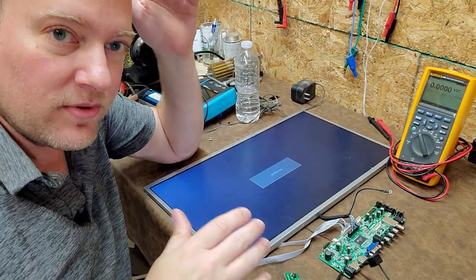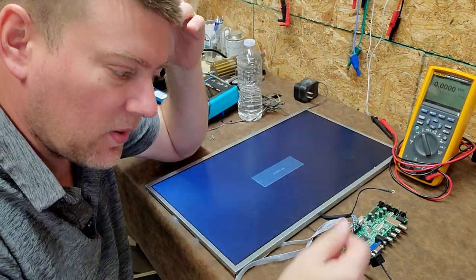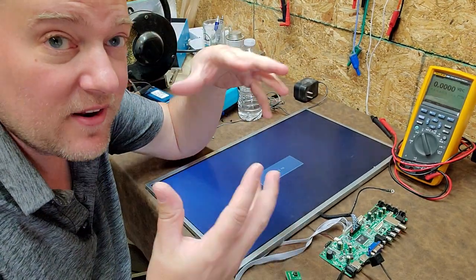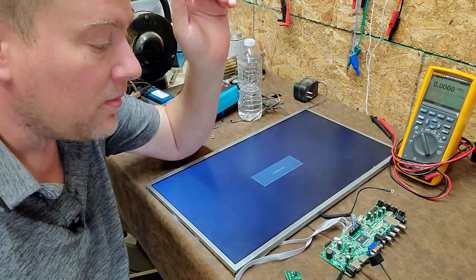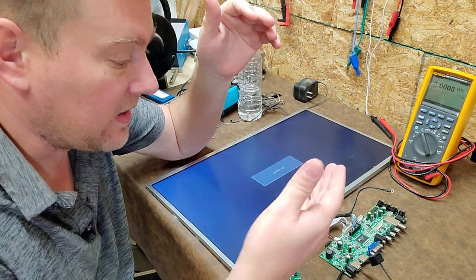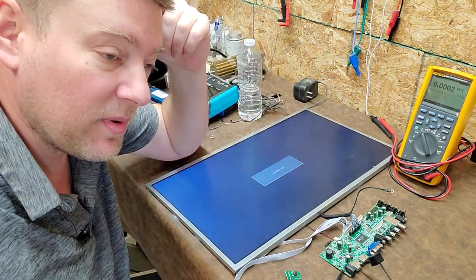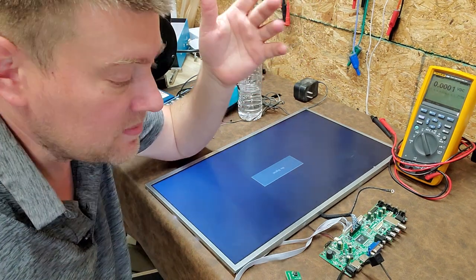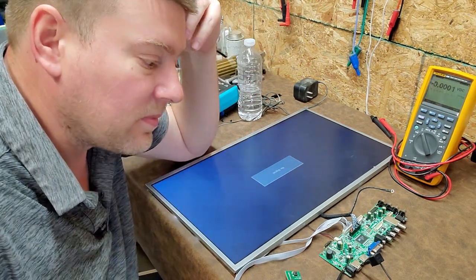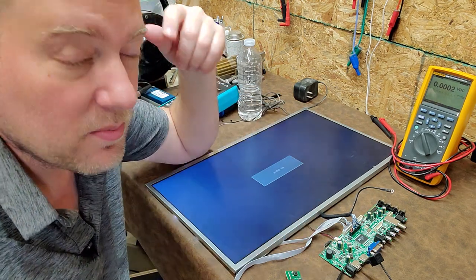I don't know the original symptom because I didn't see it plugged in at the location. There's a lot of things that could take into account why it wasn't powering up on site. But I do know that I did a physical inspection. I did see that that blade connector on the back of the display, it wasn't seated completely correctly. It could be the problem. But more than likely, what they were experiencing is a problem with the power supply.